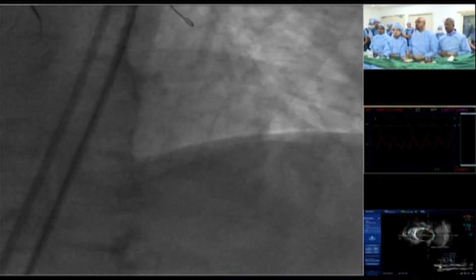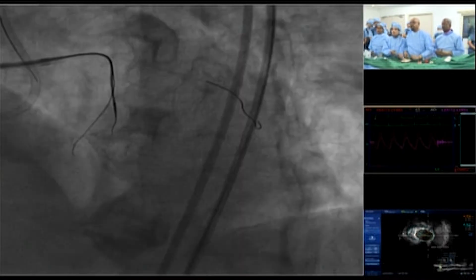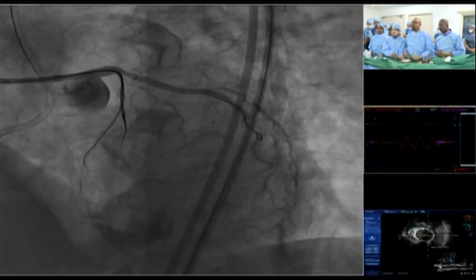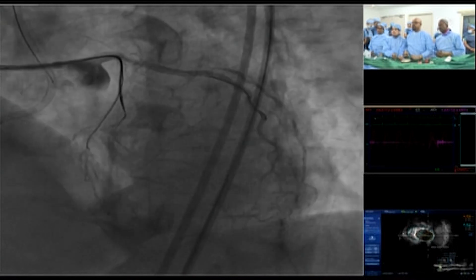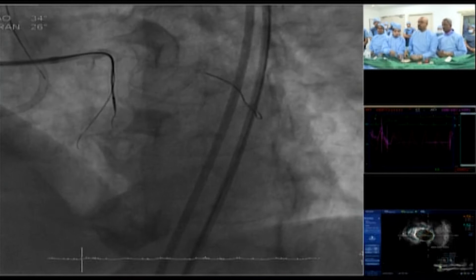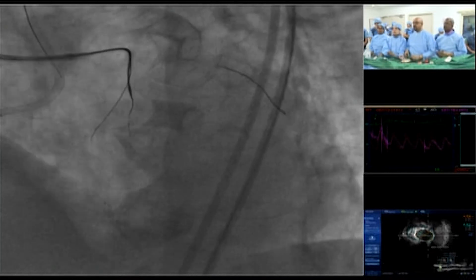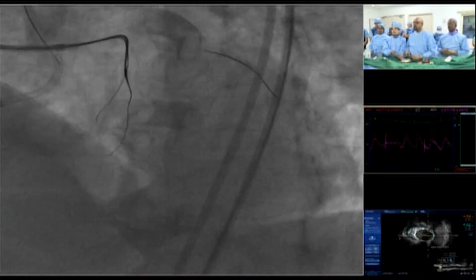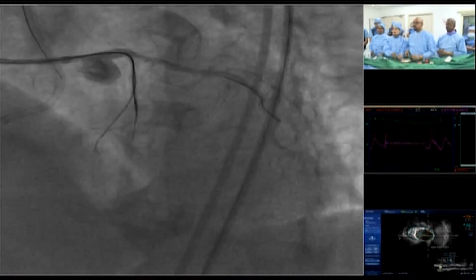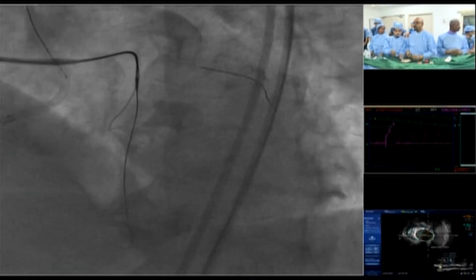Here it looks at least not so bad, right? Yes, this is better. Looks okay too. Here it looks also not bad. So I think you can make a correction and go inside. I think we are at the distal cap, and you were in the septal. Okay, probably that's fine, the distal vessel area. Good. Fine. Congratulations.